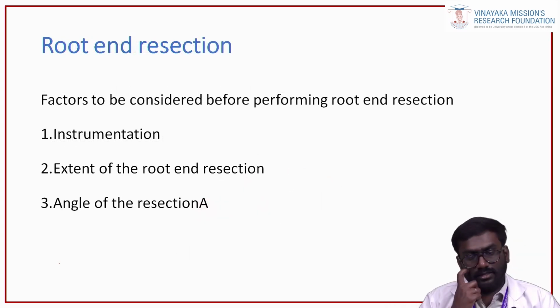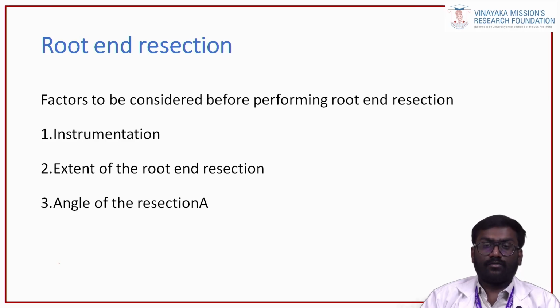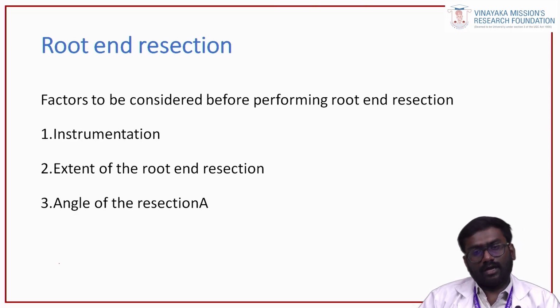Once this is done, the next step is, since the root apex is constantly in contact with the periapical area, we cut the end of the root and create a retrograde seal. The factors to be considered when performing a root end resection are the proper instruments needed to resect and refill that area, the extent of the root end resection (you cannot cut as much as you like), and the angle of resection, the beveled or non-beveled resection.